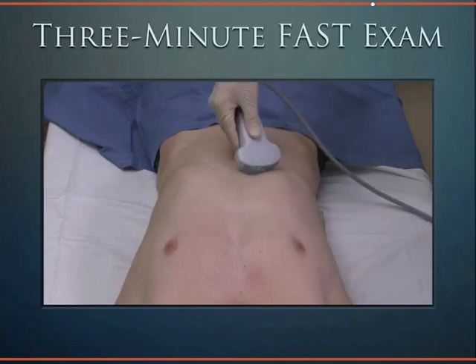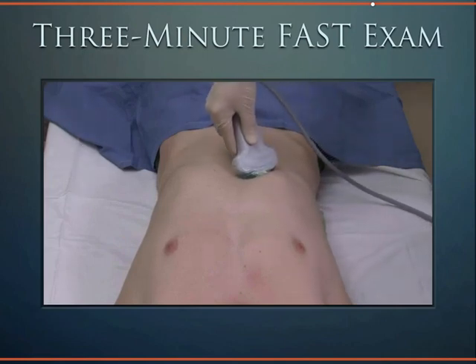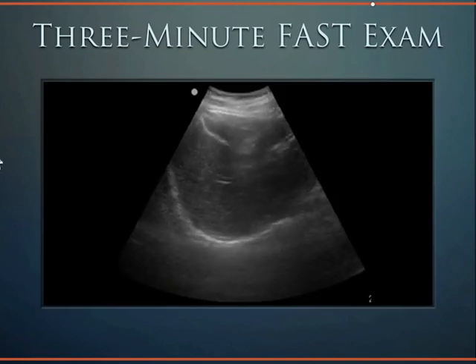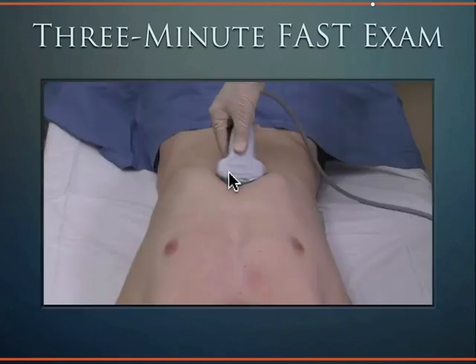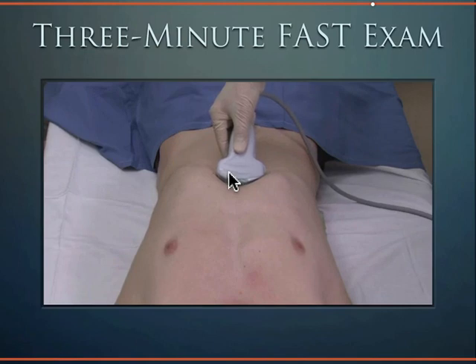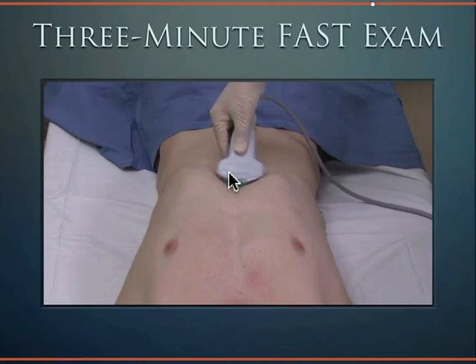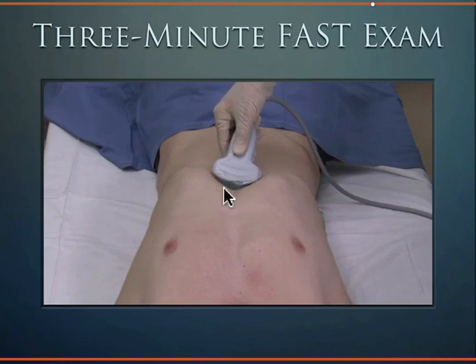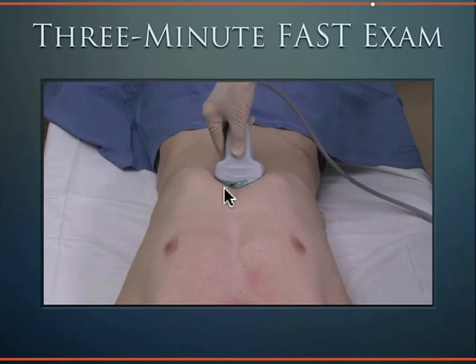The next window of the FAST exam is the subxiphoid view of the heart. Start at the liver and then use the liver as the window to visualize the heart. Start here at the liver and then slide all the way up into the subxiphoid notch.